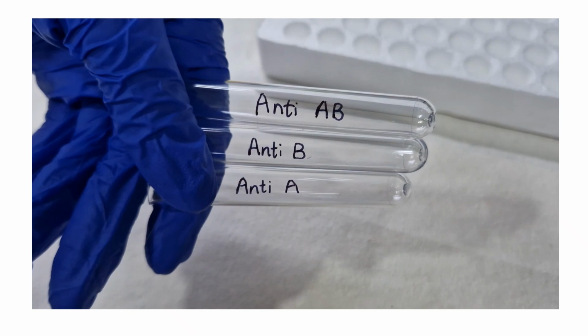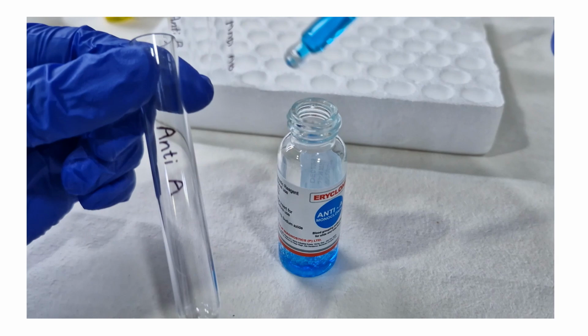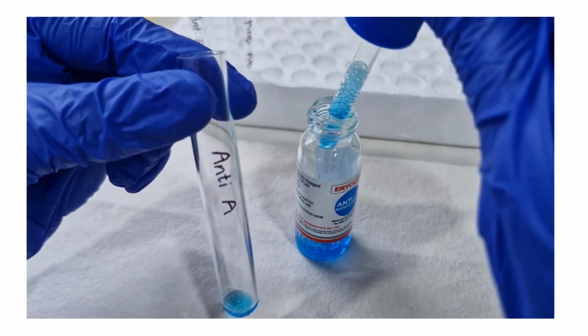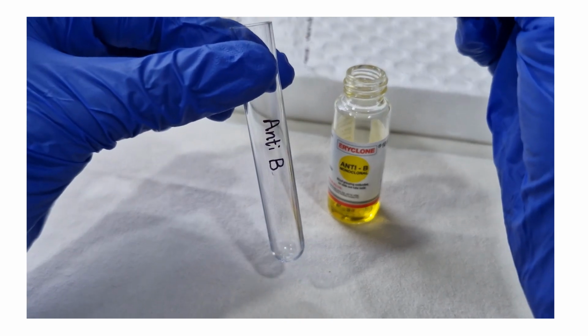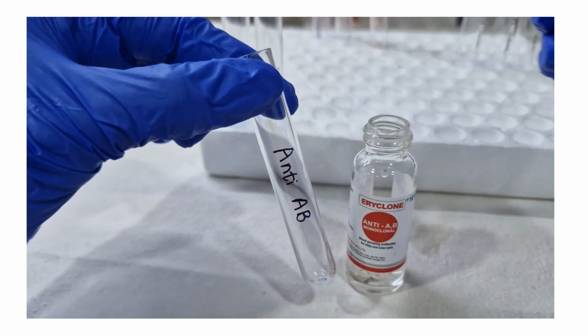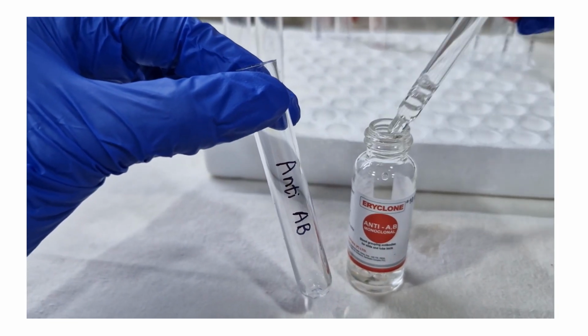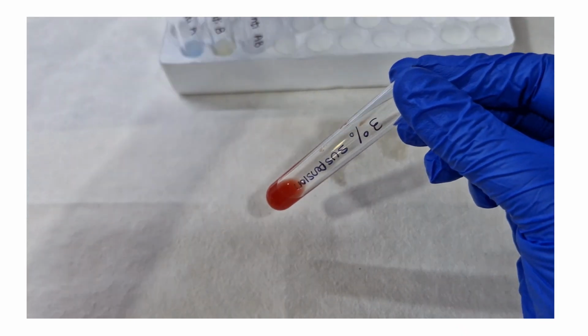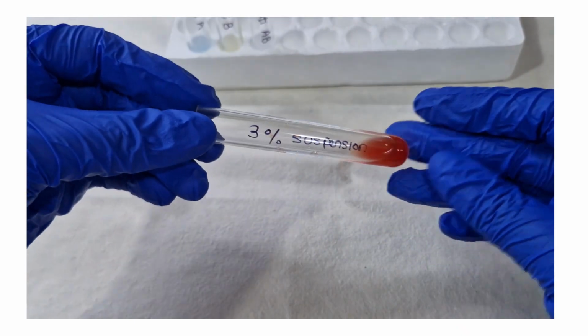Three test tubes labeled as anti-A, anti-B, and anti-AB. Beginning with forward grouping, we will add 1 drop of anti-A to the respective tube, 1 drop of anti-B to the tube labeled anti-B, and 1 drop of anti-AB to the respective test tube. This is the patient sample from which we prepared 3% red cell suspension.